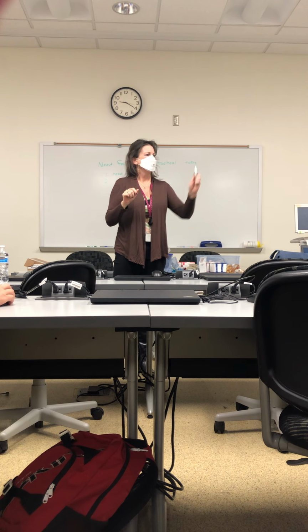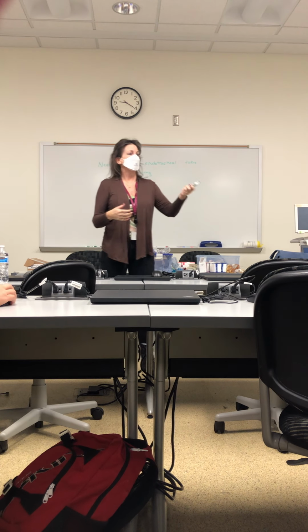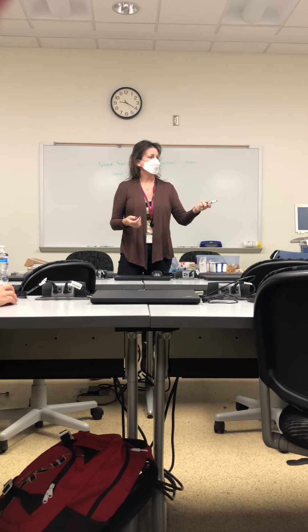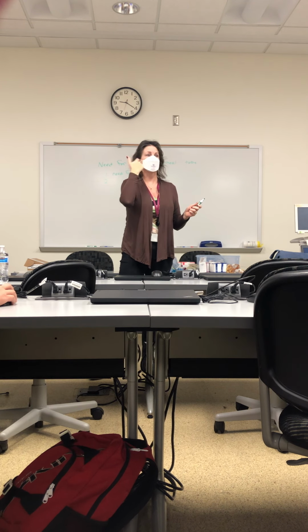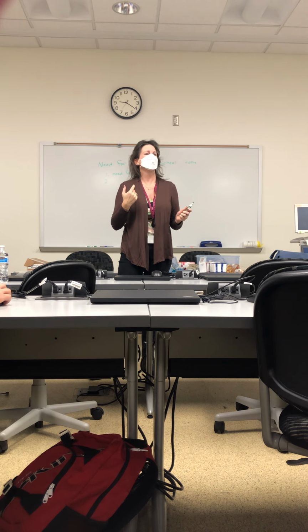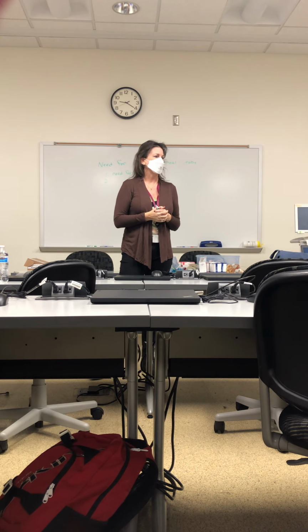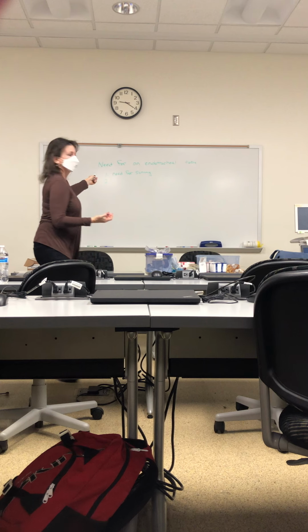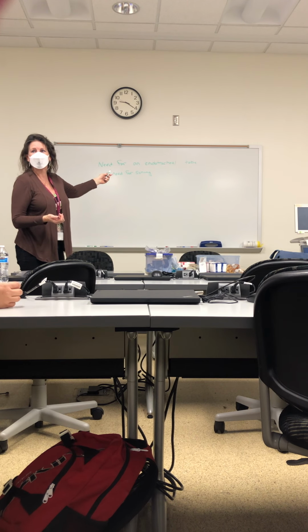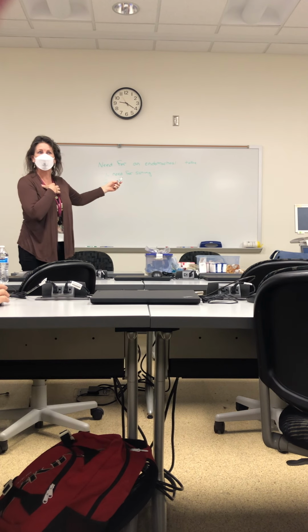You can use a nasal airway. You guys have to remember this; this is putting it together. You have to use a nasopharyngeal airway, an NP airway. So you lube up the airway and you put it in the patient, so then you can frequently suction and it's not going to scrape up the mucosa. So we're going to put an NP airway. We're suctioning and suctioning, and they start deteriorating because we're not able to get enough secretions out. Number one of the reasons that we need an artificial airway or an endotracheal tube is the need for suctioning a patient, to keep their airways clean.